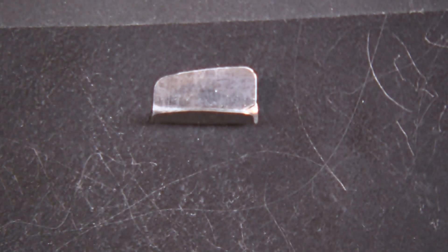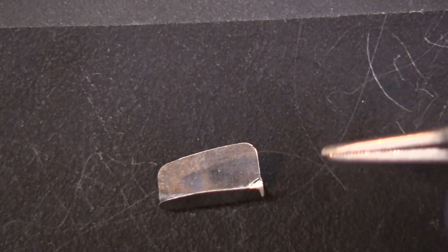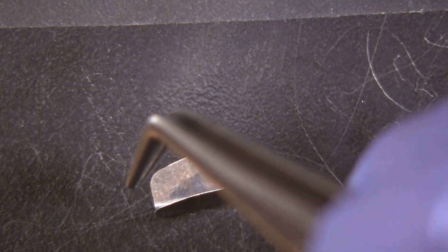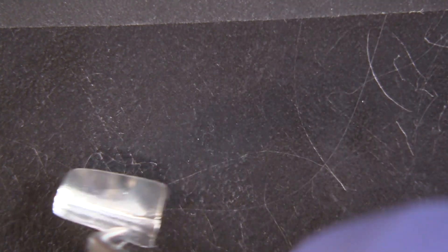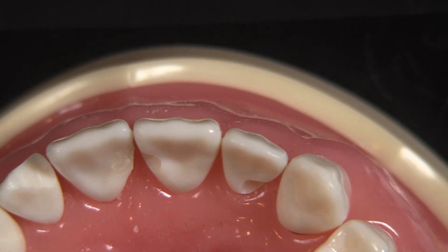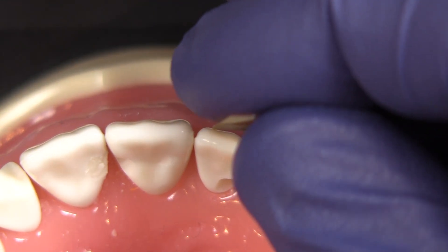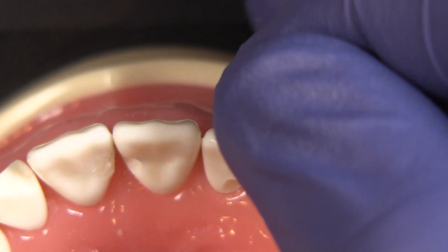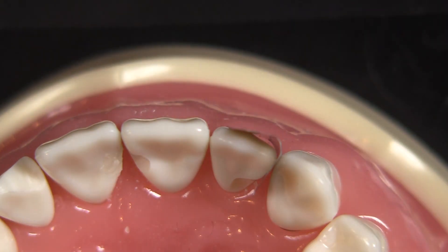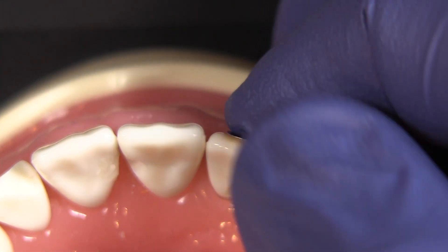If you look at these matrix bands, they all have a tapered design — one side is longer, one side is shorter. I like that because it helps with access. Obviously the shorter end helps with access and doesn't block as much, but the larger end gives me versatility to where I can choose to place that towards the gum tissue if I have a restoration that wraps around the tooth a little bit more. In this case, because of the shape of that prep where it's wrapping around towards the cingulum, I will place that larger end down towards the gingiva.